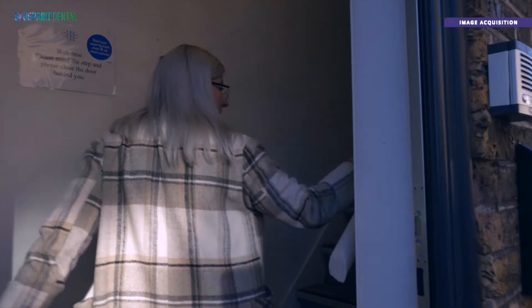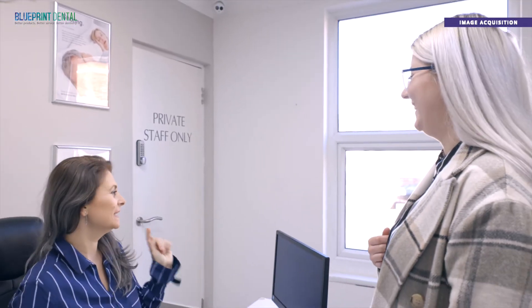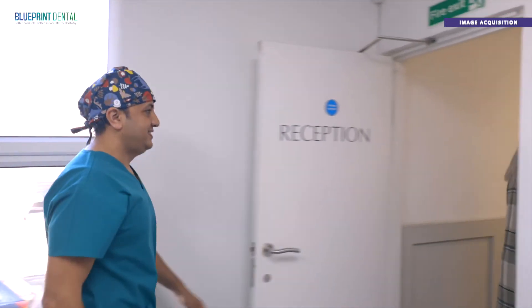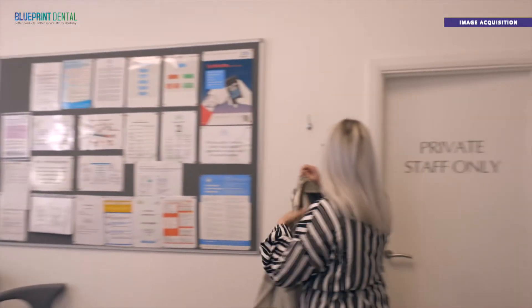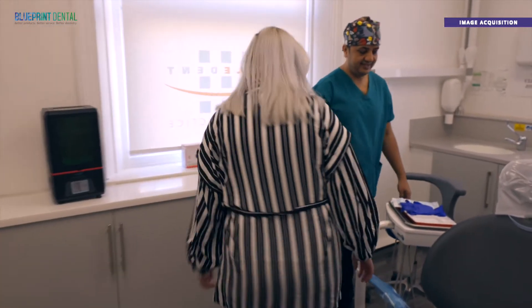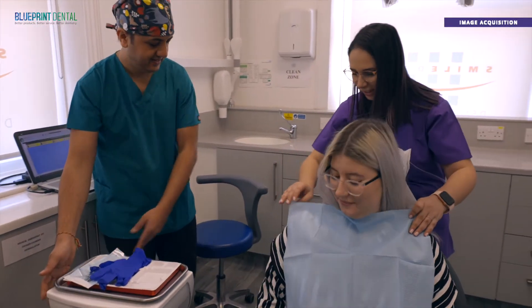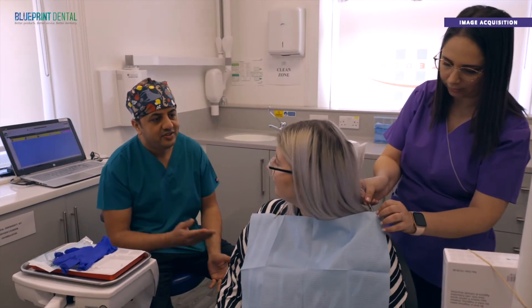In this video we'll be focusing on image acquisition using the Medit i500 intraoral scanner. Whatever your speciality, fast, accurate digital image acquisition is the vital first step to any successful treatment, and the Medit i500 is rapidly becoming the go-to scanner of choice for dental surgeries across the UK.